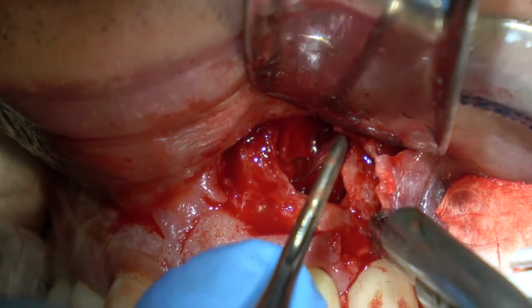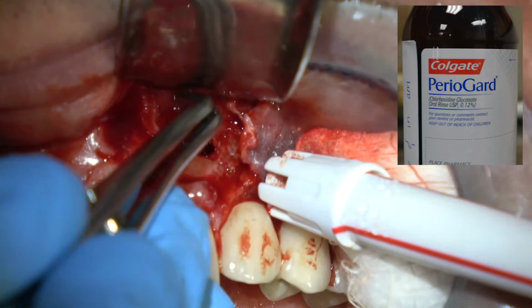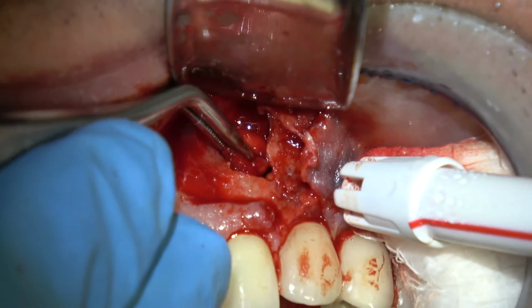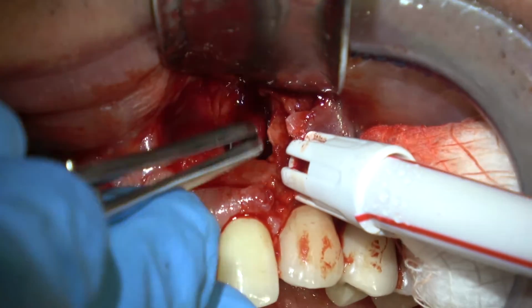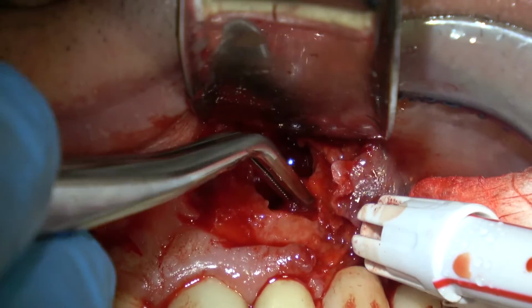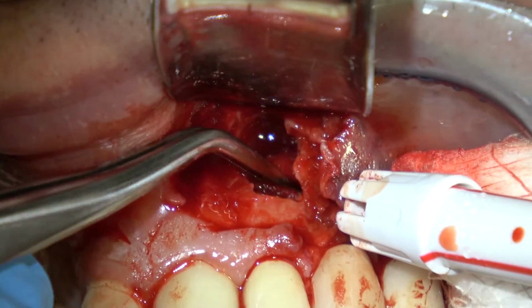and enhances healing. Then I'm going to come back with something to wipe it out with a small cotton ball or large cotton ball. Either Paragard, water, whatever you want to use, just to wipe it and clean it out real well. Last little remnants. This was Paragard, which is chlorhexidine. Now the mobility of the tooth has not changed. It's still about a class 2 mobility.